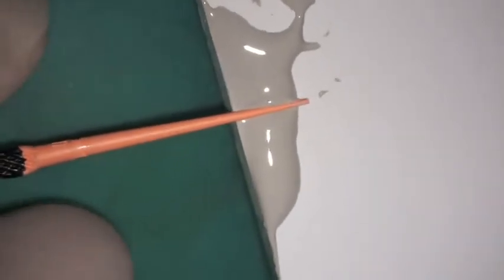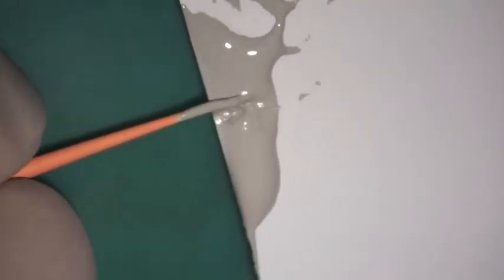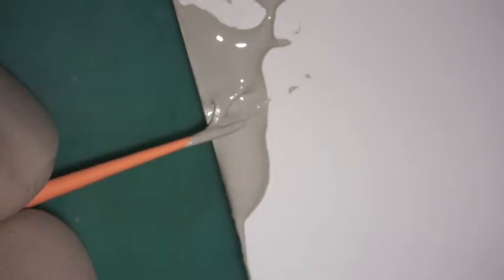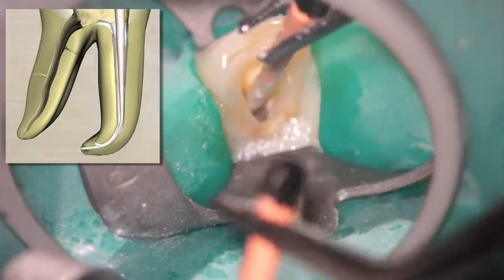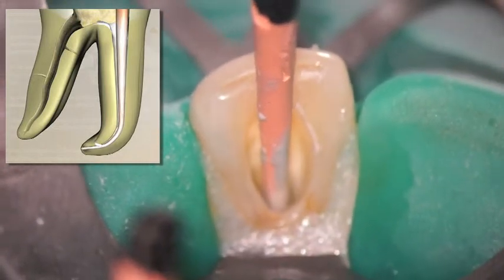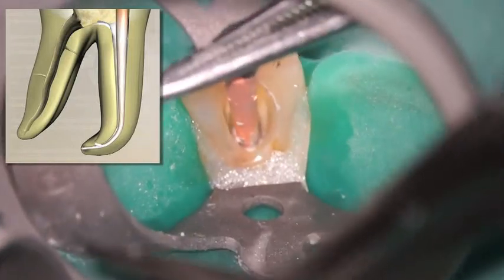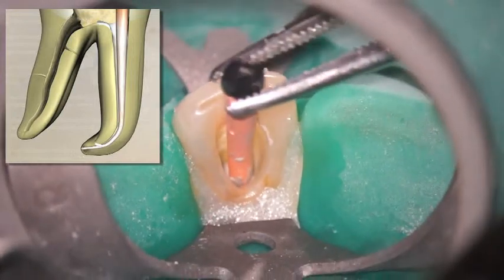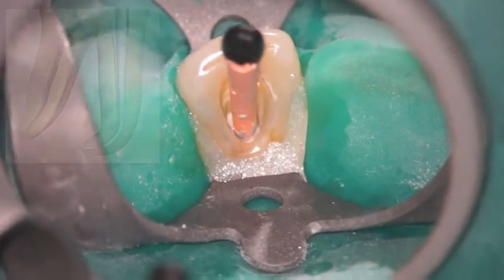Here's an illustration of using Kerr Extended Working Time Sealer. I like that mix to a certain consistency and then place my gutta percha cone right on the edge of the mixing pad so that I can literally roll it, making sure that the sealer is circumferentially all the way around the gutta percha cone. Instead of placing my sealer in the root canal system with a paper point, which sometimes leaves little bits of paper fibers in the root canal system, I like to place my sealer with a cone that I refer to as a sealer cone. I like to do that first and then place my master cone.